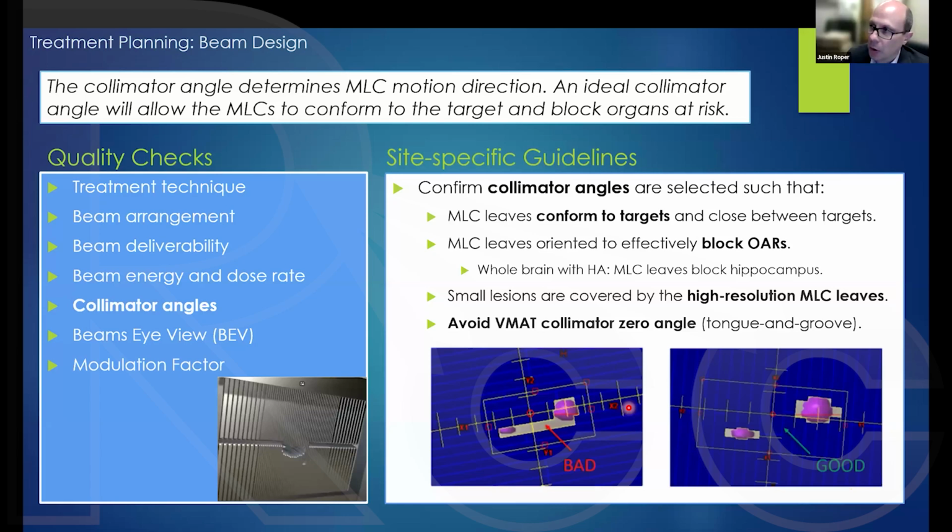And there's a follow-up question also regarding hippocampal sparing in terms of dose constraints in the case of 30 gray. And I believe that that's actually most of what has been published in the literature in terms of hippocampal avoidance in the context of whole brain RT. Well, the one thing I would mention is that the most important thing is the number of fractions, right?